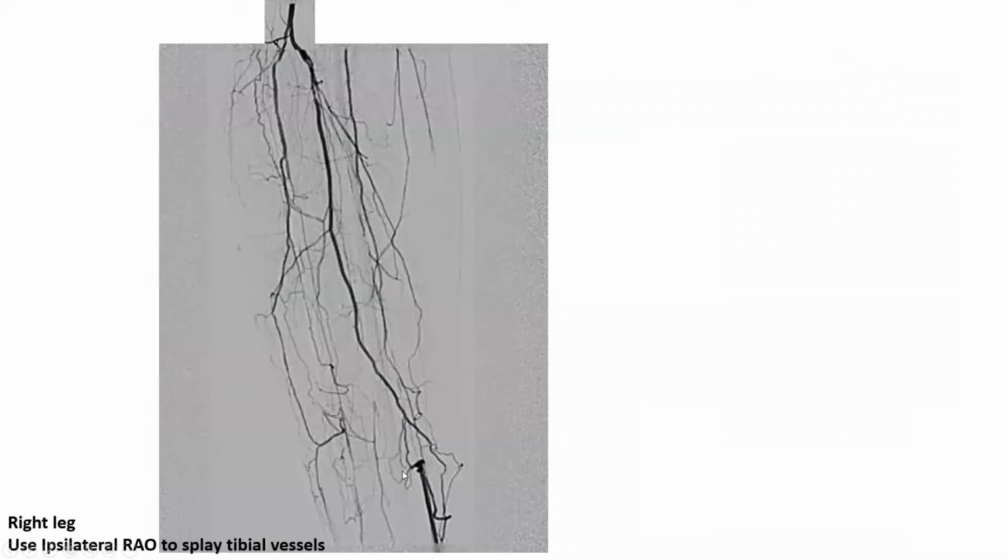This is an angiogram of infrapopliteal extensive occlusion. So here I want you to recognize, this is a distal popliteal artery, and this is in subtraction angiography. In this maze of occlusion and collaterals, always guide yourself by the proximal cap and the distal reconstitution. Look for that late distal filling reconstitution, and look for wherever the contrast hangs proximally, and between those two, you know where your occlusion is. Okay, then you can take more magnified images to further localize your proximal cap.